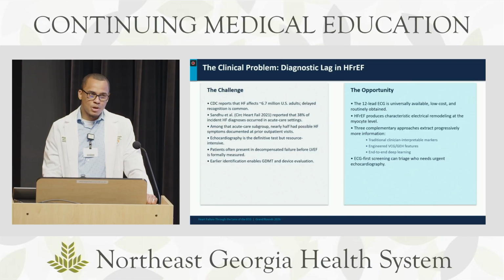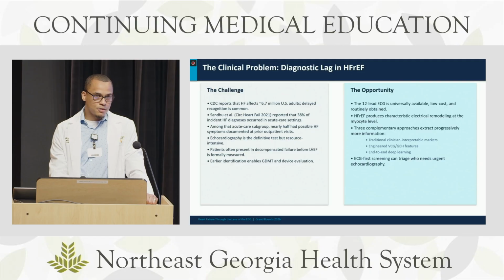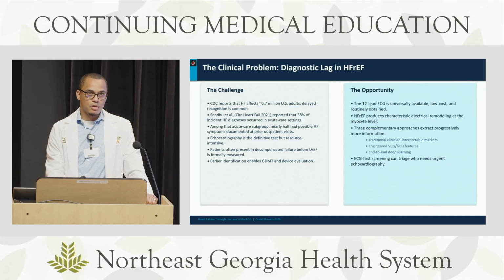One of the things is that an echocardiogram is something you cannot do in a regular office. It's resource intensive. It's a relatively easy test, but it takes going to a lab, getting a technician, and scheduling all those things. Whereas EKGs are pretty much everywhere. They're in your office, they're in the hospital on every floor. It's a modality that is available everywhere, and it's relatively cheap compared to echoes or other modalities.